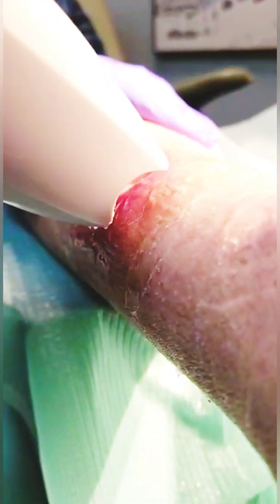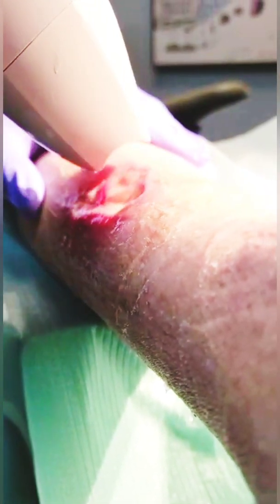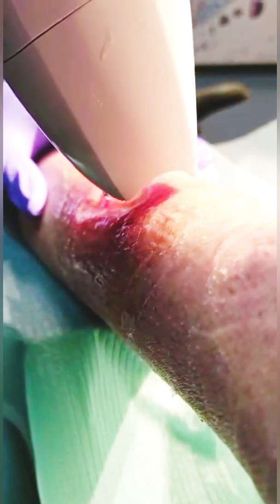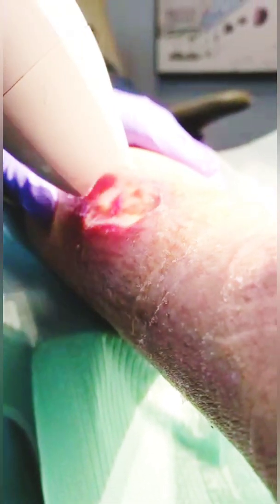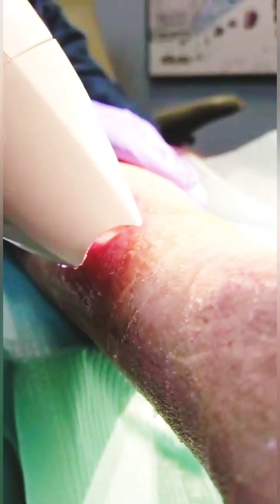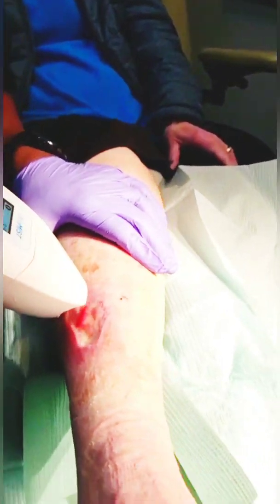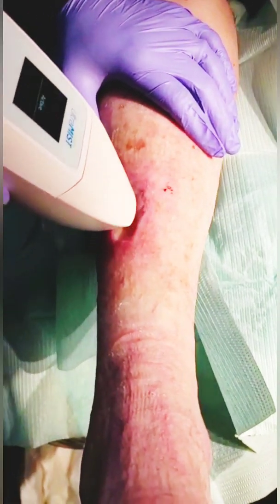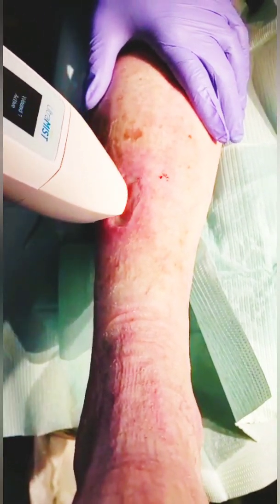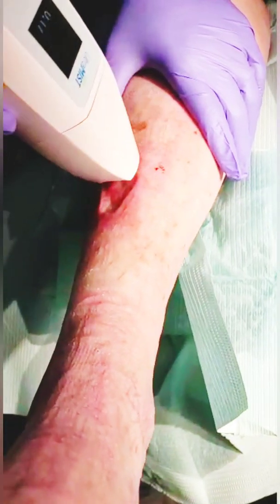It works great for diabetic foot ulcers, venous leg ulcers, and pressure ulcers. There's actually a lot of evidence showing that with a deep tissue injury that has not yet advanced into a wound, using this on a DTI can keep it from advancing into a stage 3 or stage 4 ulcer — and many times actually resolves the DTI before it becomes anything. It's used a lot in inpatient wound treatment in hospitals for that — any type of wound, anywhere on the body.